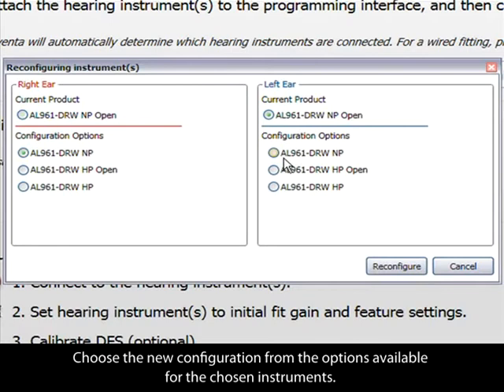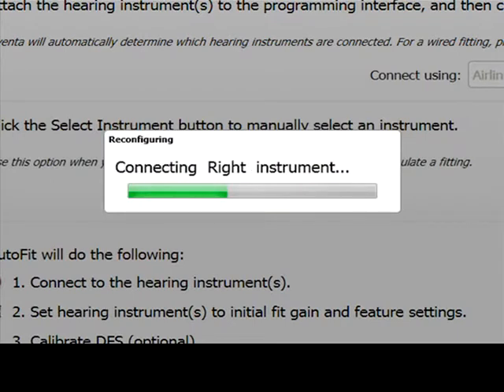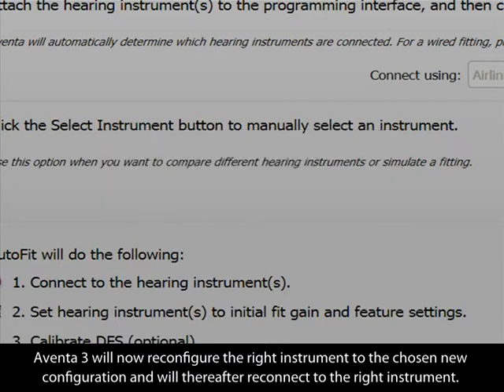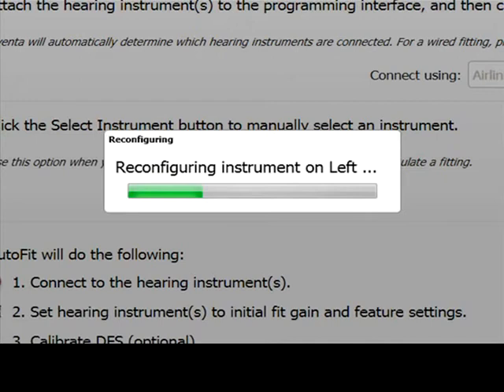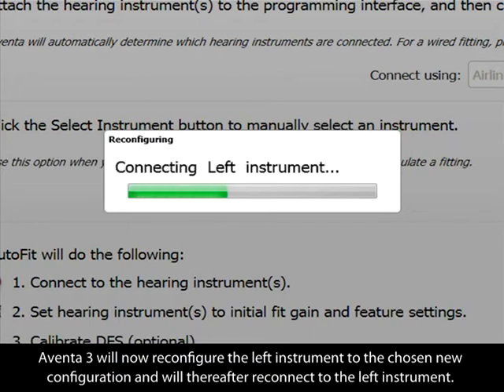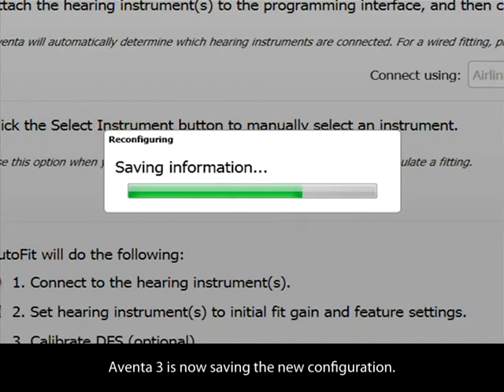Choose the new configuration from the options available for the chosen instruments and click Reconfigure. Aventa 3 will now reconfigure the right instrument to the chosen new configuration and will thereafter reconnect to the right instrument. Aventa 3 will then reconfigure the left instrument to the chosen new configuration and will thereafter reconnect to the left instrument. Aventa 3 is now saving the new configuration.